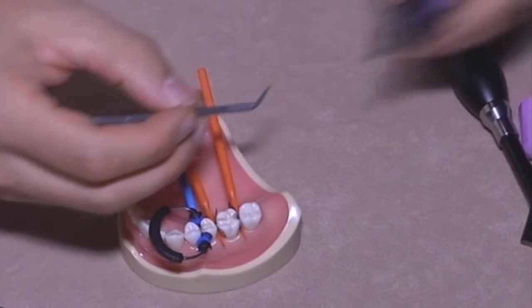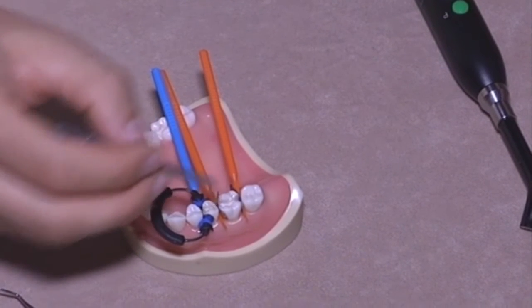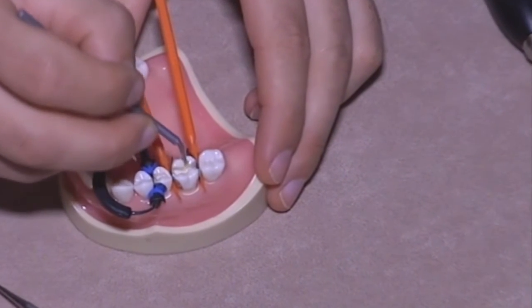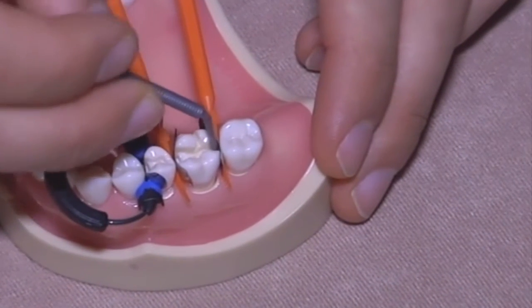Let's get another drop of universal adhesive. Let's imagine we had pre-etching of the enamel, and let's place again the bonding resin everywhere.